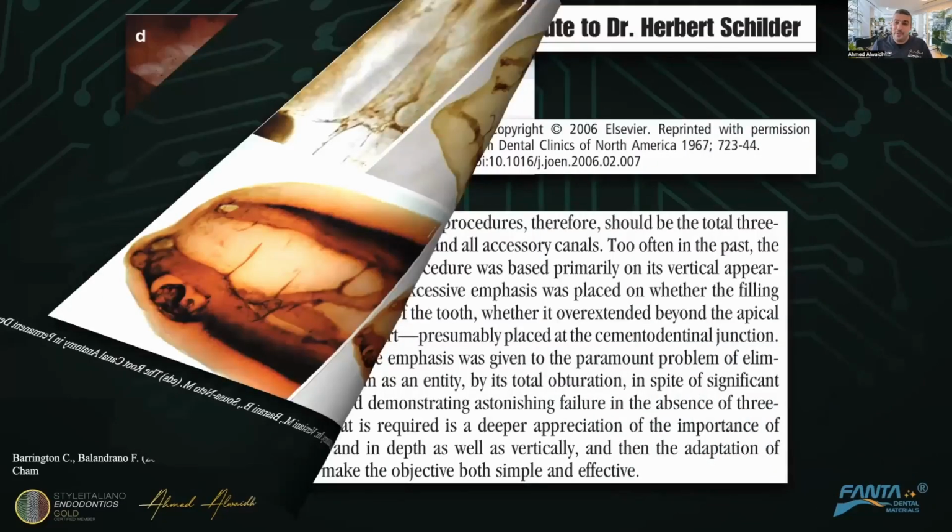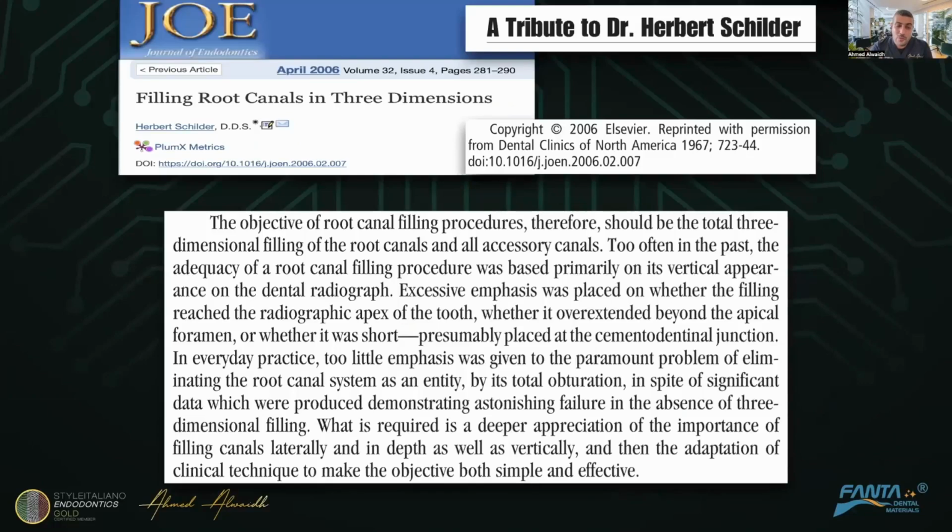So he was the first who introduced truly three-dimensional obturation of the root canal system, and warm vertical compaction is the name of his technique, and so far we call it Schilder obturation or the Schilder technique.